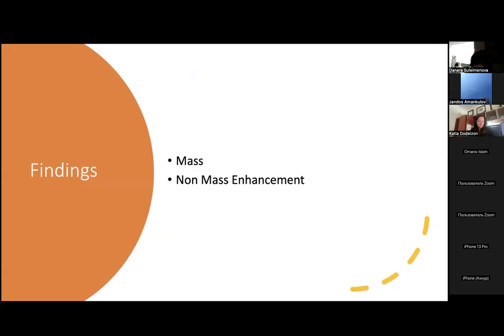And now in the last few minutes, let's just talk about what are the findings when we actually look for cancer and what are the descriptors utilized, what's suspicious and what is not. So previously, prior to the last issue of the BI-RADS manual, we had 3 potential findings on MR, which was focus, mass, and non-mass enhancement. Now a focus has been completely removed, and we only have 2 options, mass or non-mass enhancement.